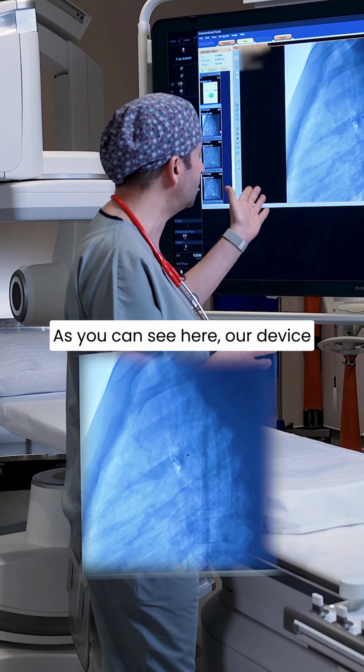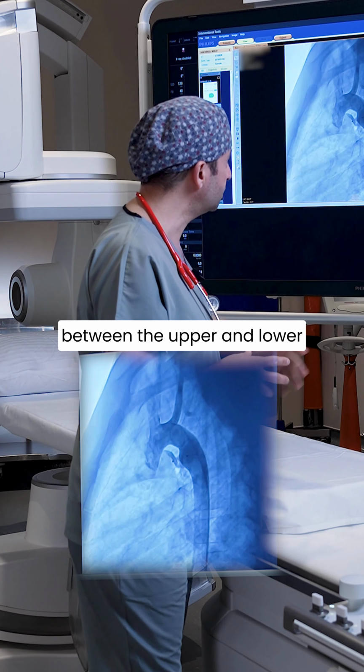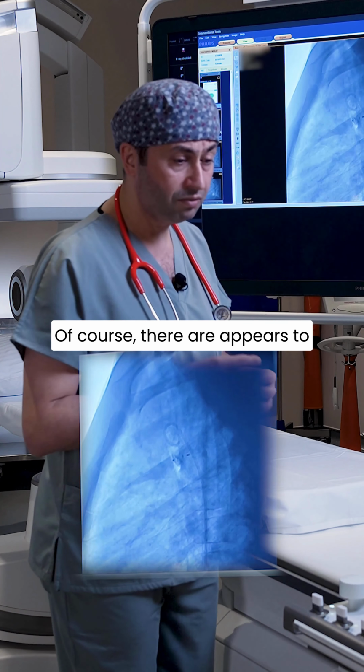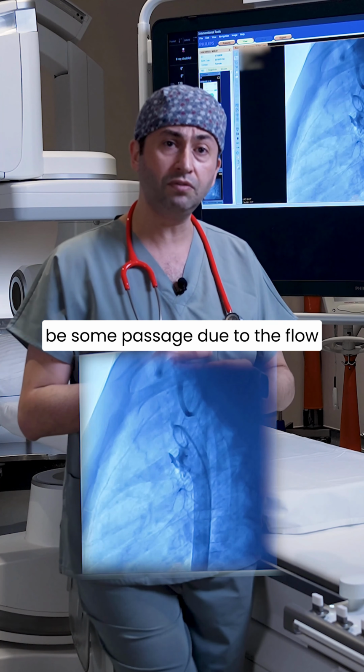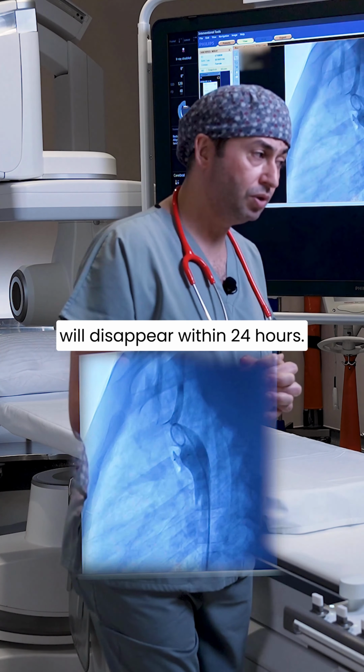As you can see here, our device is in the correct position. There is no pressure gradient between the upper and lower parts of the main artery. The hole is almost completely closed. Of course, there appears to be some passage due to the flow of contrast under high pressure through the device, but these will disappear within 24 hours.